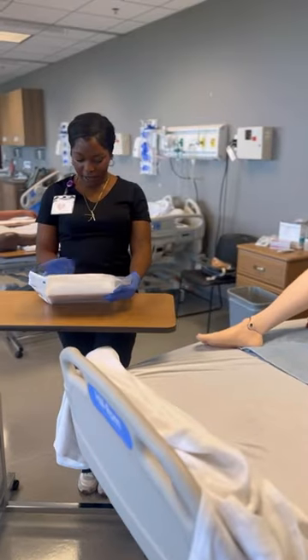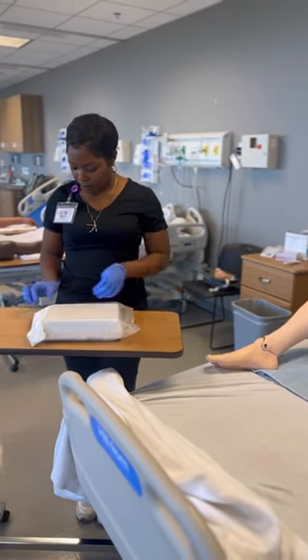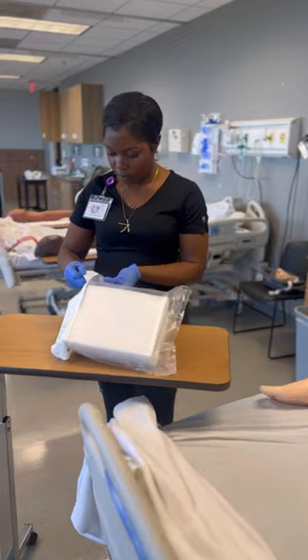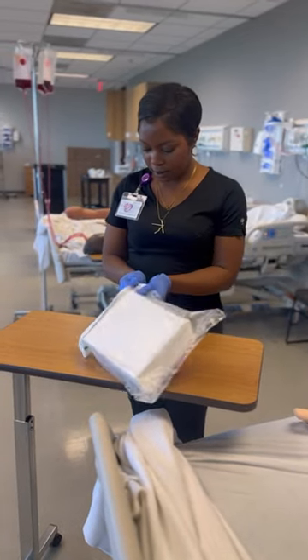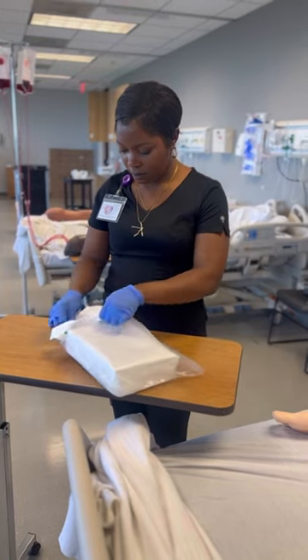Now it's time to gather our supplies. You want to inspect your package, making sure there are no punctures or tears and that it is not expired. Also, this part is not sterile — you do not open up the package wearing sterile gloves, but you can wear clean gloves.